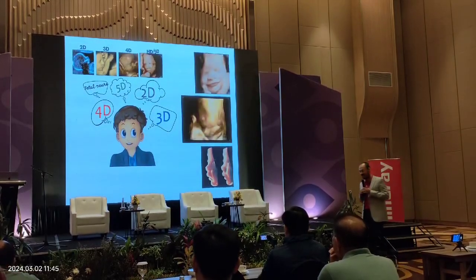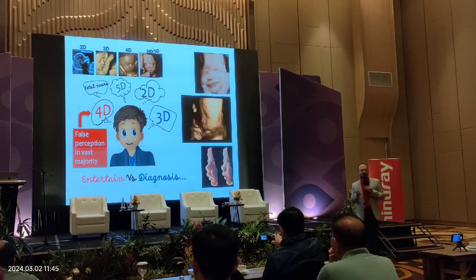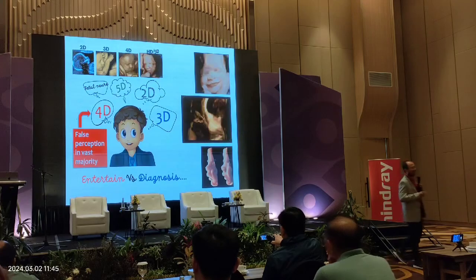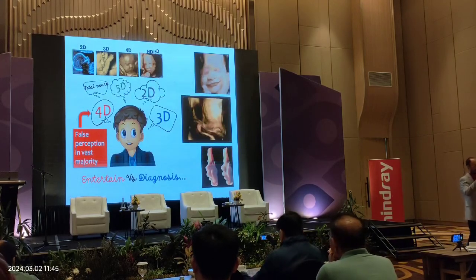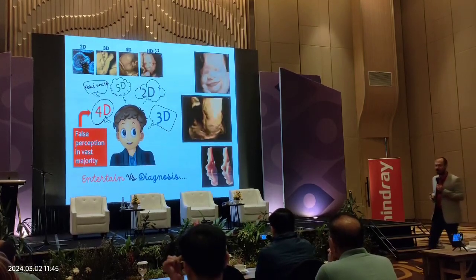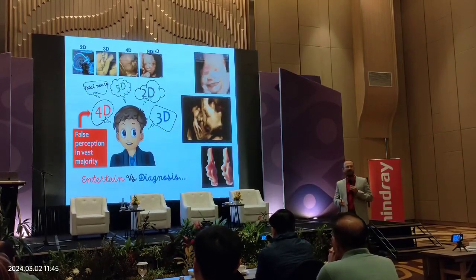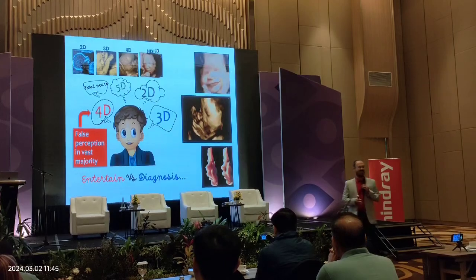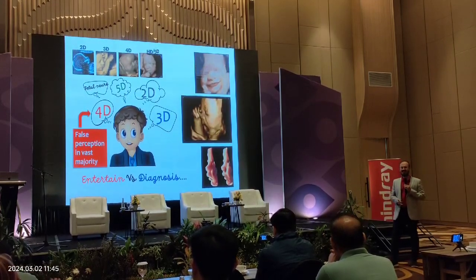It is very clear that the vast majority of people, not only outside the medical field but also our colleagues, are still very confused about what 3D, 4D, and 5D are. And also the patients. Patients are always asking to do 4D.